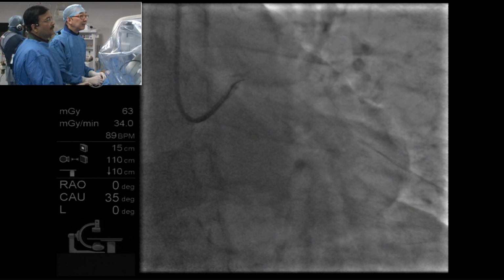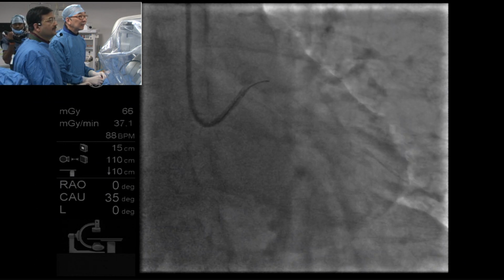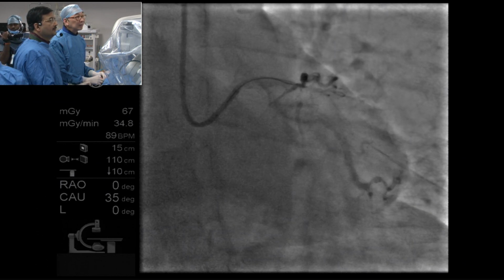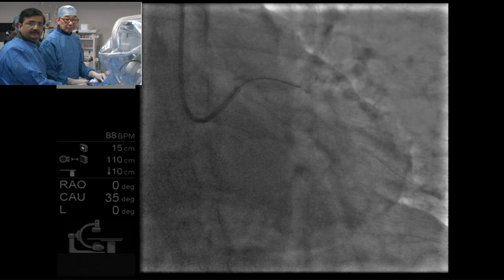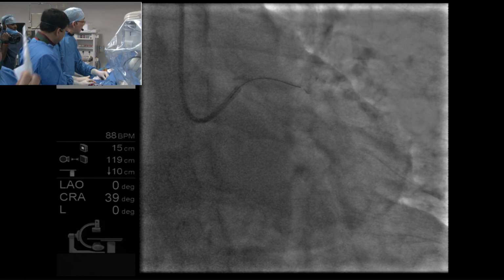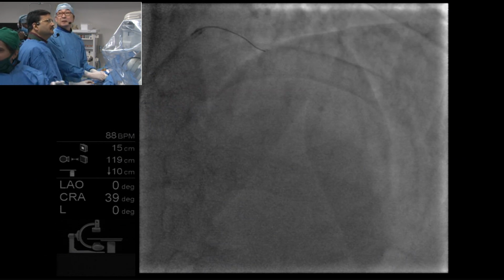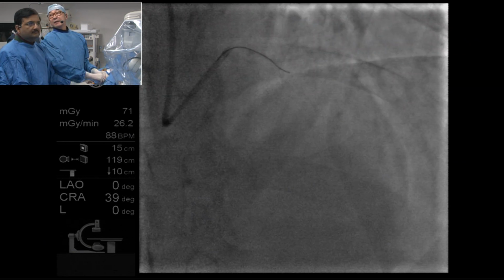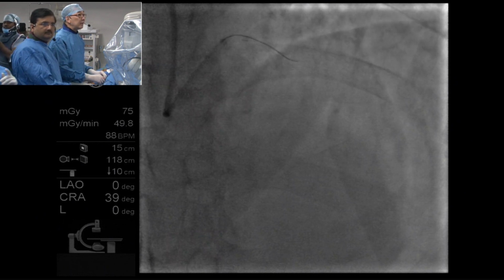So actually the recent meta-analysis has shown that OCT-guided PCI has a similar outcome compared to IVUS-guided PCI. So actually we can use IVUS as well. So we're talking about OCT-guided PCI versus IVUS-guided PCI. I think we have an expert here, Dr. Yamasaki. Can you answer a question for them? IVUS guidance and OCT guidance.